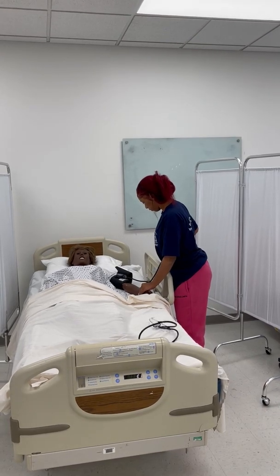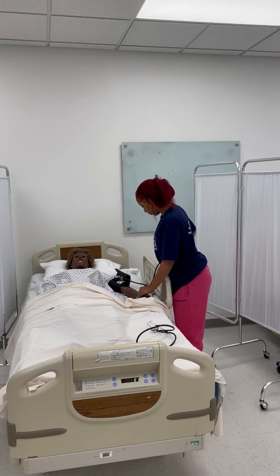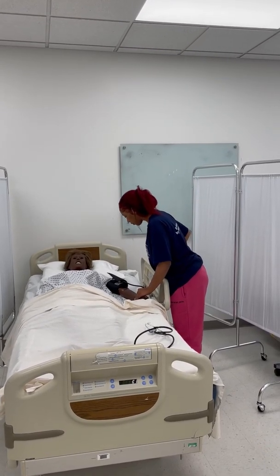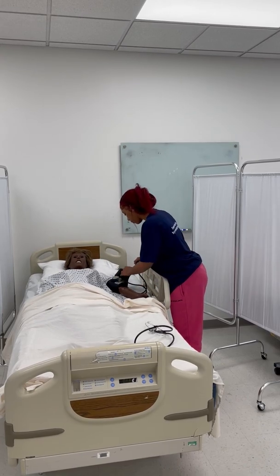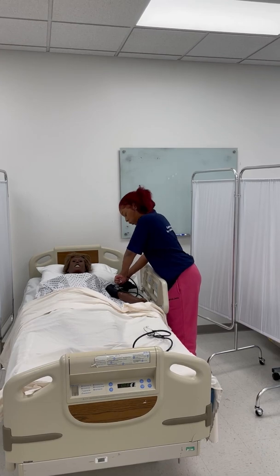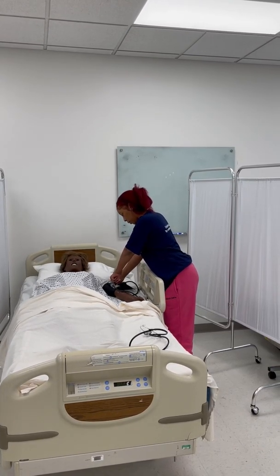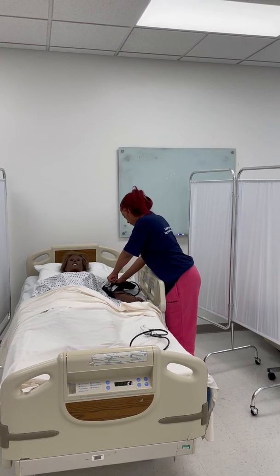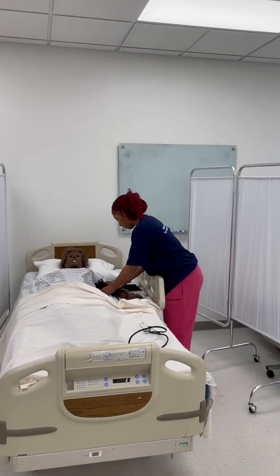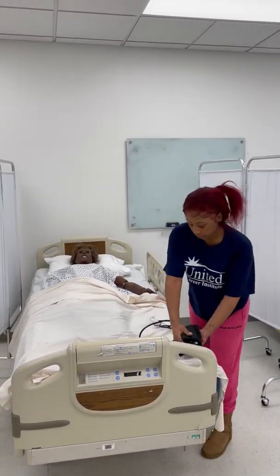Once she loses the patient's radial pulse, she will deflate the cuff and she will know where she needs to pump it up to get the patient's blood pressure. It stopped at 120. So when I pump it up again, I'll pump it up to 140 or 160. Okay. Get that off here. She needs to wait 2 minutes before rechecking the blood pressure.